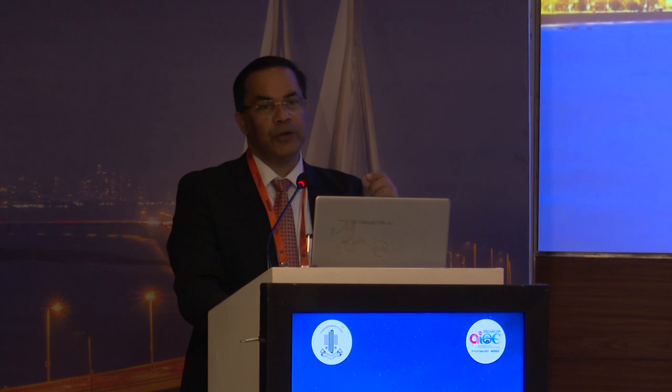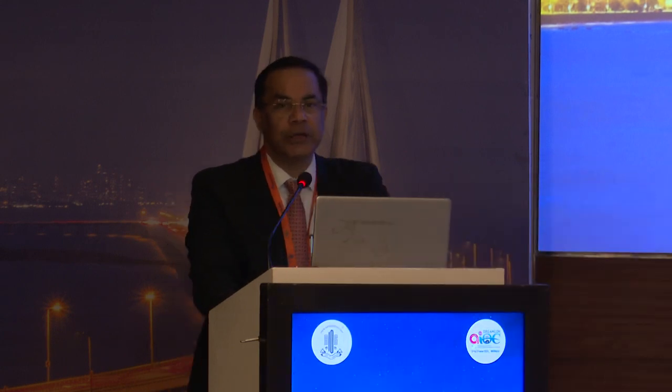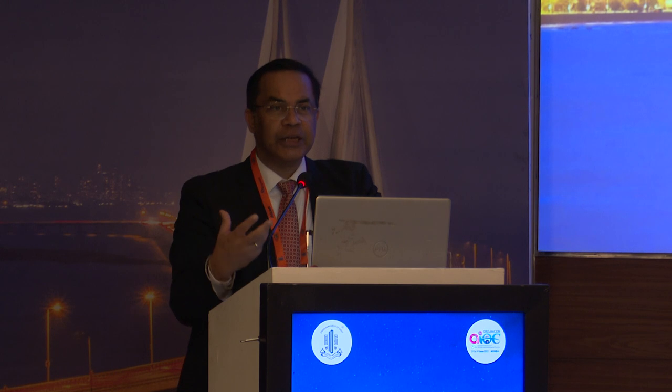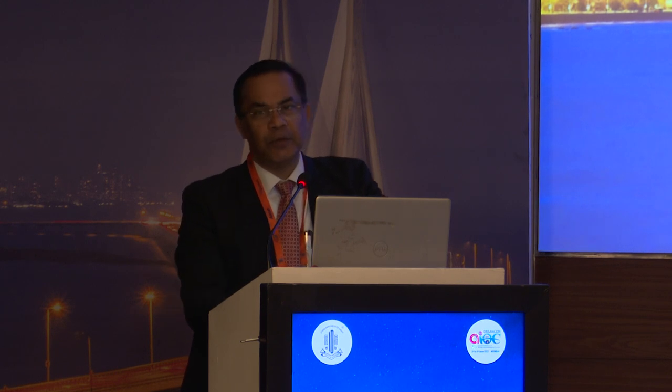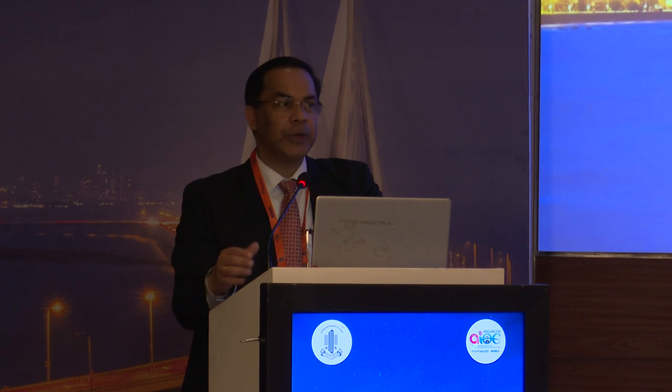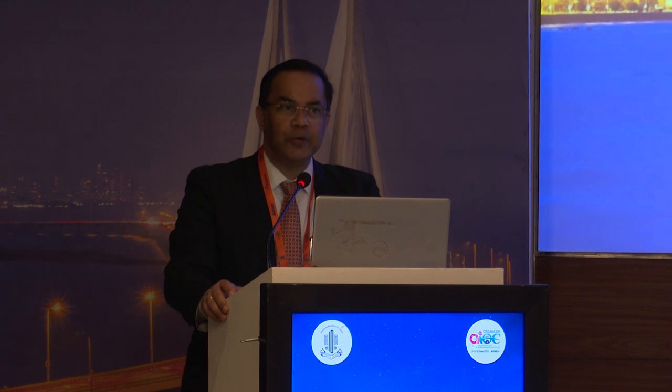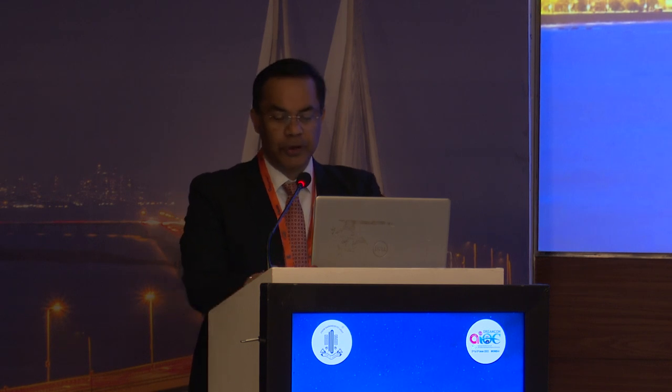Right from when you are making an incision, and with the best of the surgeons, sometimes the incision can go faulty. How do you rectify it? When you are injecting viscoelastic, when you are doing the rexis, there may be sudden deepening of the anterior chamber, there may be sudden shallowing of the anterior chamber intraoperatively. You may have a posterior capsule tear, you may have a drop, so on and so forth.